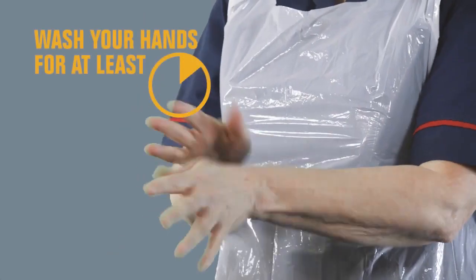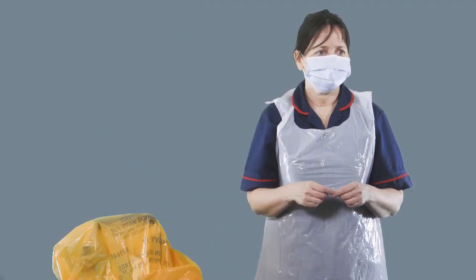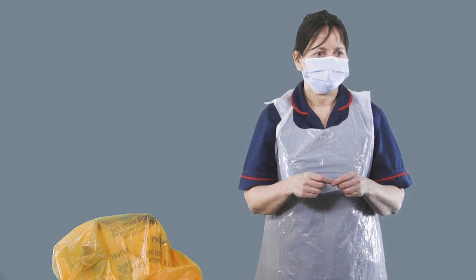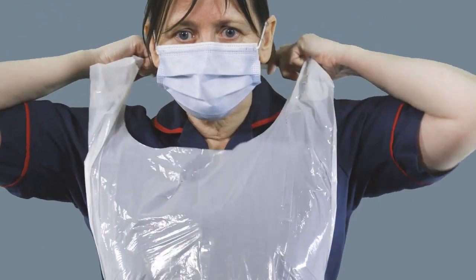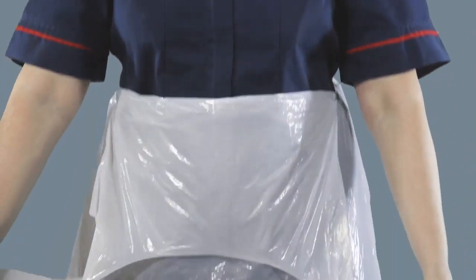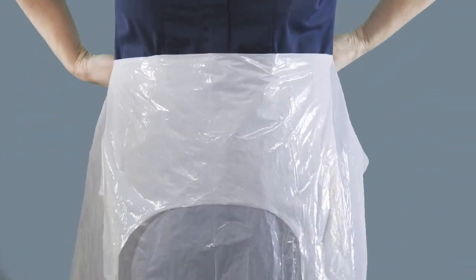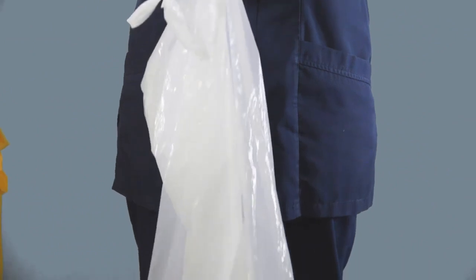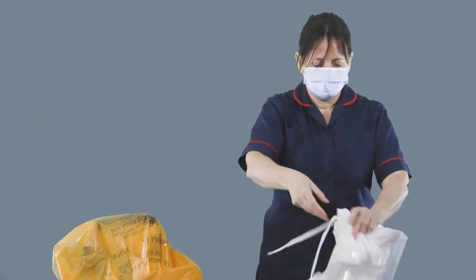Now clean your hands again with the hand sanitizer. Next, remove your apron. Unfasten or break the apron ties at the neck and let the apron fold down on itself. Break the ties at the waist and fold the apron in on itself. Do not touch the outside, then discard into your orange bag.